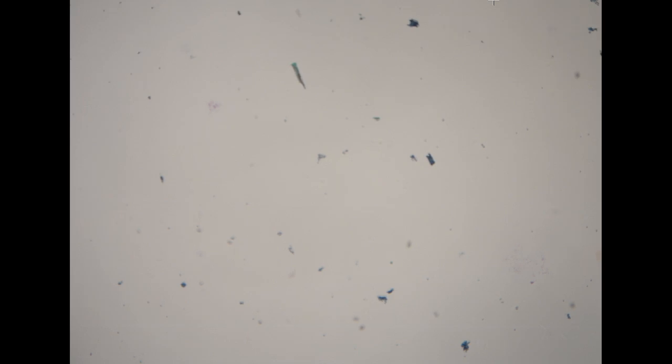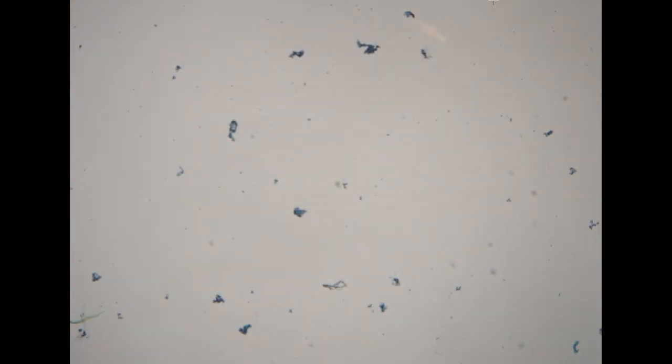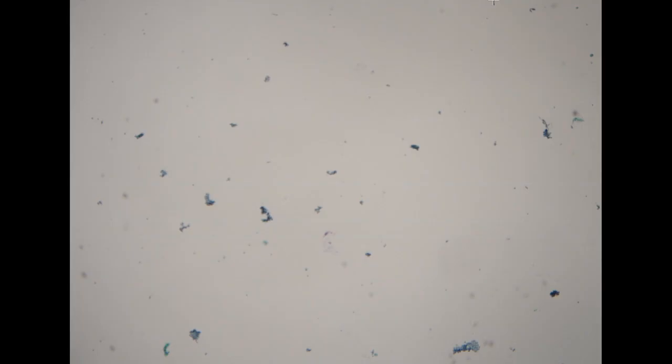The next case is also a thyroid fine needle aspiration. You can tell by the cellularity, it is less cellular than the previous specimen. However, in the background, it still shows no colloid, but you see tight clusters of cells scattered throughout the entire specimen.